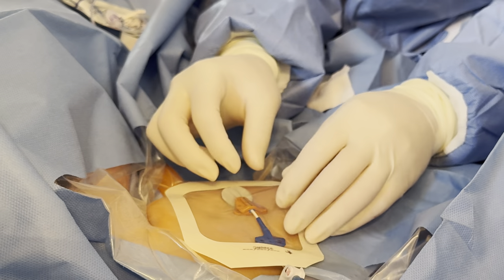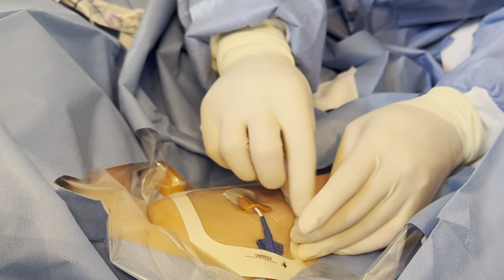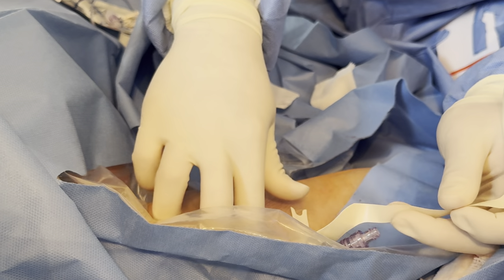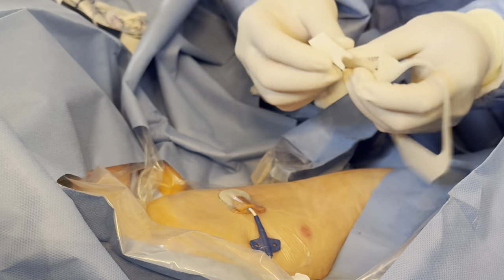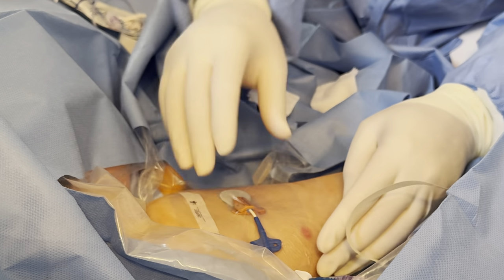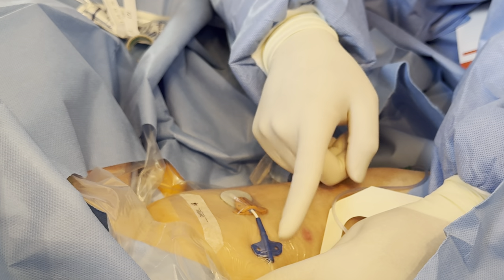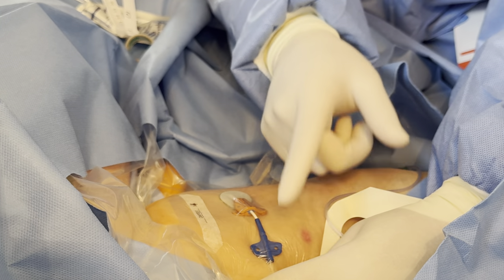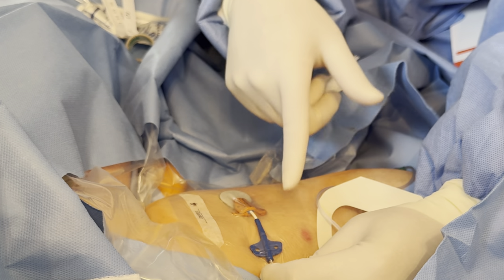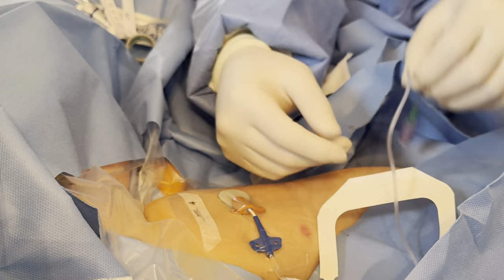While I'm lifting up the edges, you want to be careful and hold the edges down while removing because it will lift the dressing and might disrupt it a little bit. Put this down, date and time it — then we're good. Notice I'm not applying a stat lock, sutures, or anything else — I don't need any of that. In fact, if you apply a stat lock, it's just going to get in the way. It's not extra secure — if the patient is strong enough to pull the catheter out of the SecuraCath, that stat lock isn't going to help anyway. Save your money, save your time.